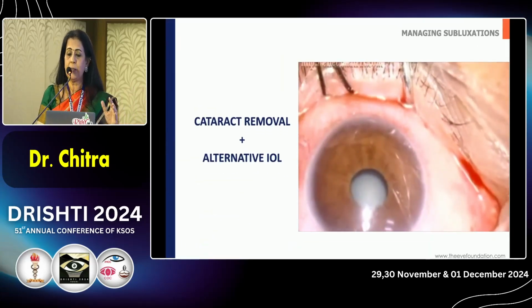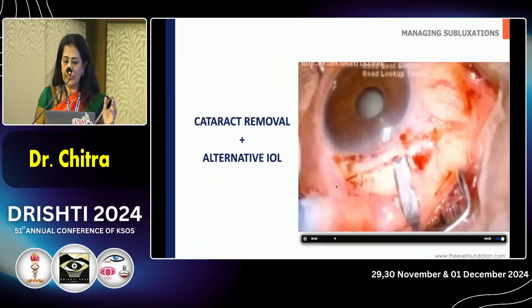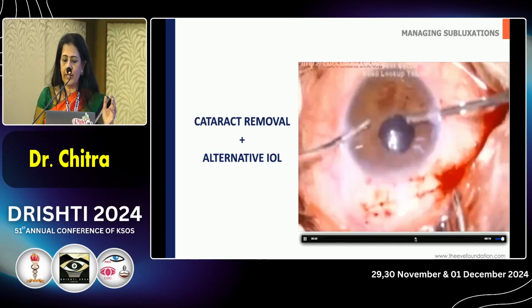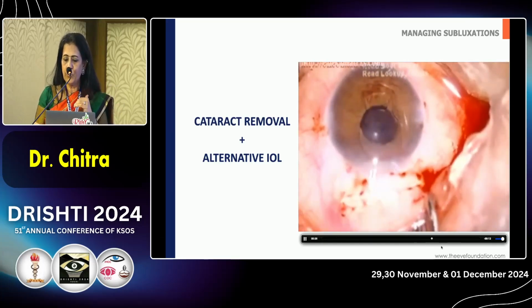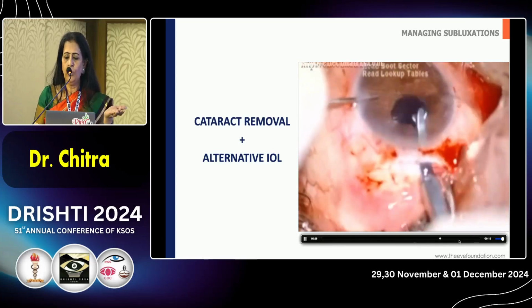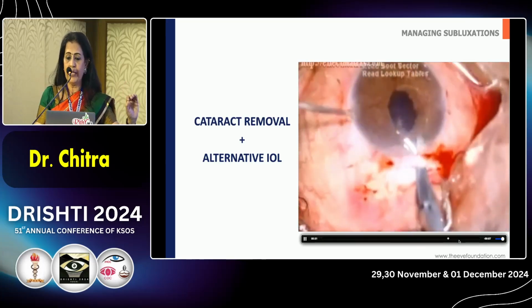If I have a severe subluxation, I'm not going to go into great detail. Here I would do an iris clip IOL after scooping out the lens matter and position the iris clip the way we all know, like place it so that enough iris is tucked in.